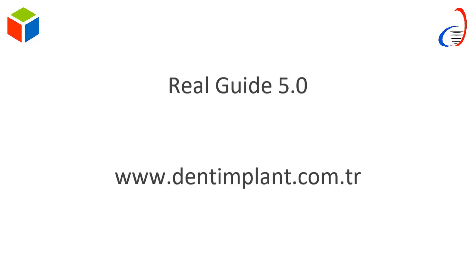Okay, I see if there are other questions. I'm looking at the questions too, so if I find something interesting, I can answer. You need the internet connection, yes. We also have an online shop if you want to purchase our software on subscription, monthly subscription. Anyway, remember the first month is a demo version, a pro demo version, so you will be able to import the DICOM, STL, and do a planning.